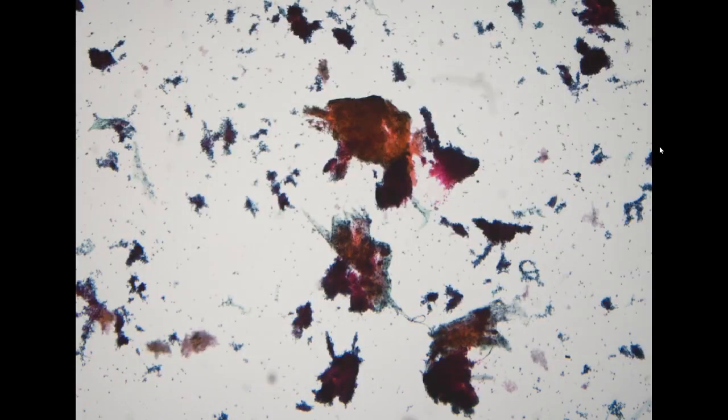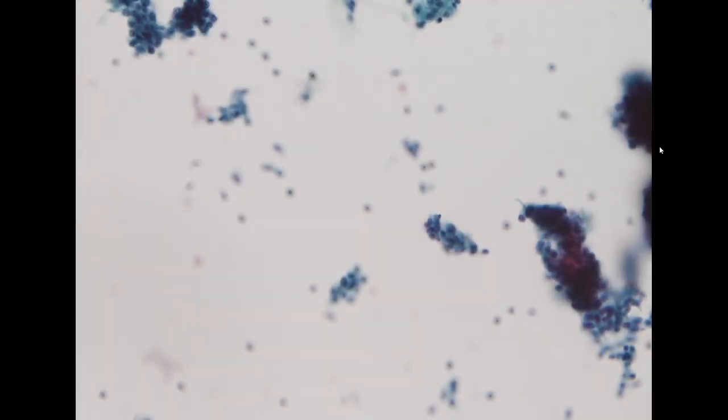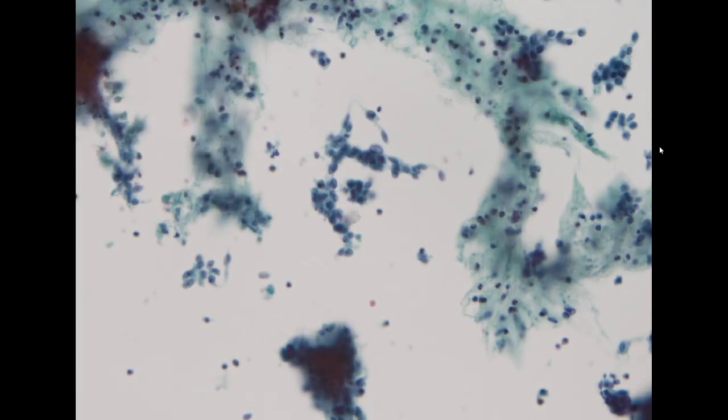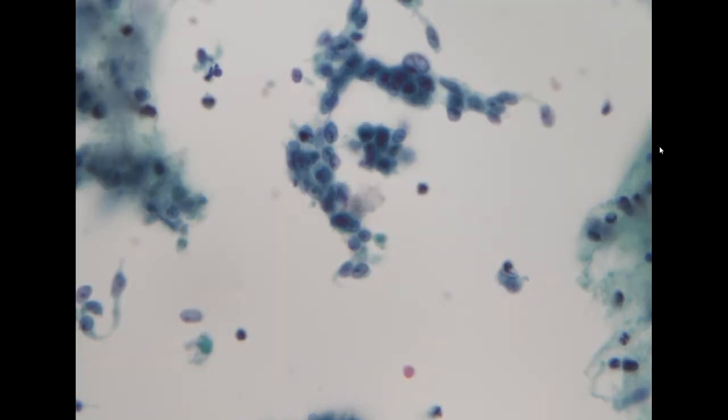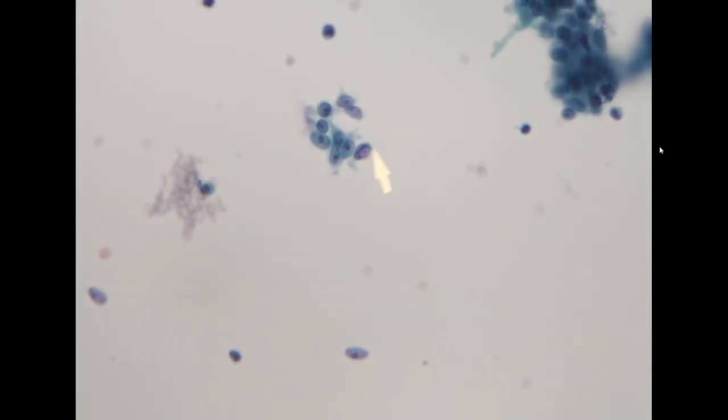So this is the liquid-based preparation, and we see a lot of cellular fragments. The cells have an oval to spindle morphology in tight cohesive clusters. The nuclei show a vesicular chromatin pattern, and quite often you can see irregular nucleoli.